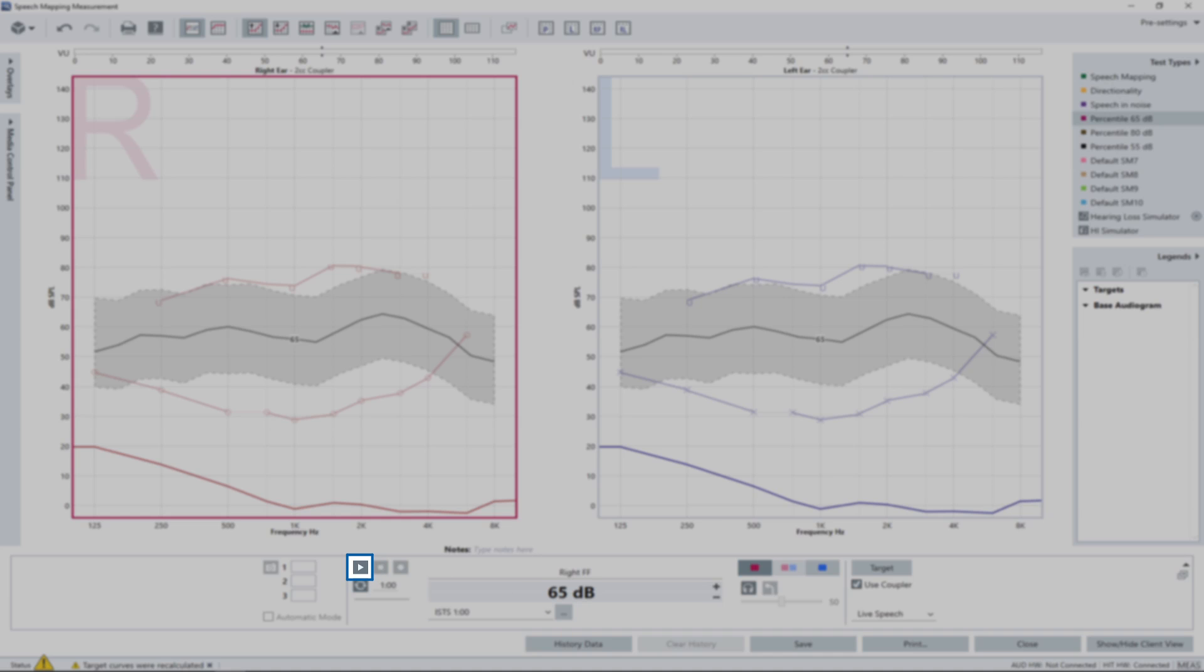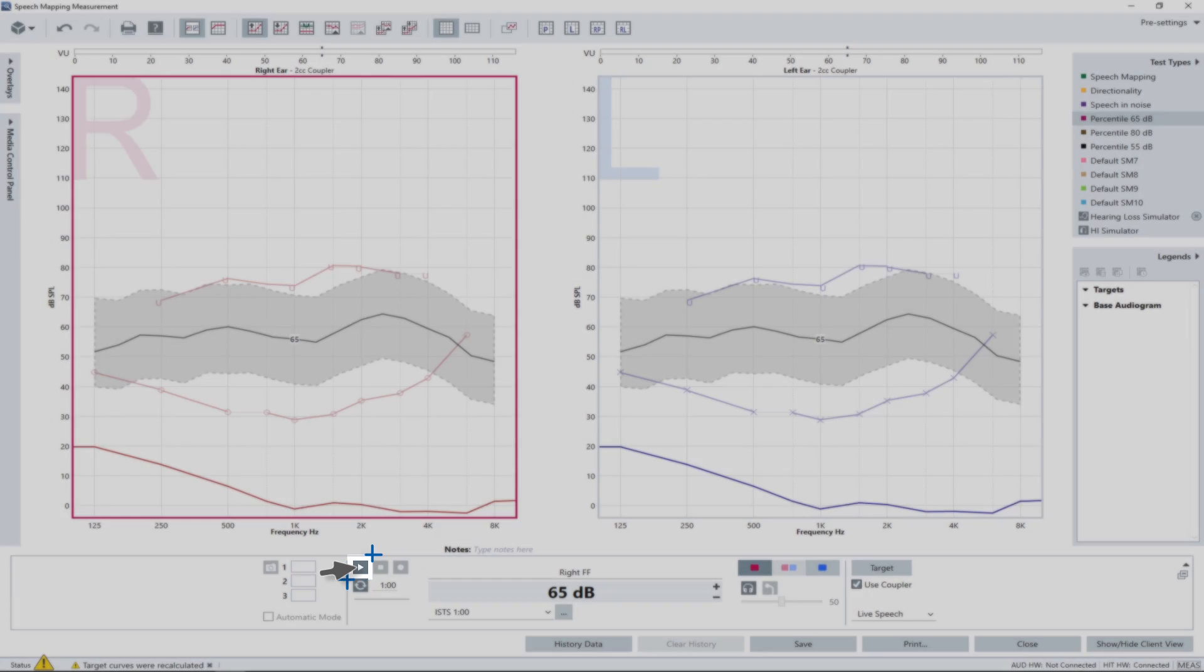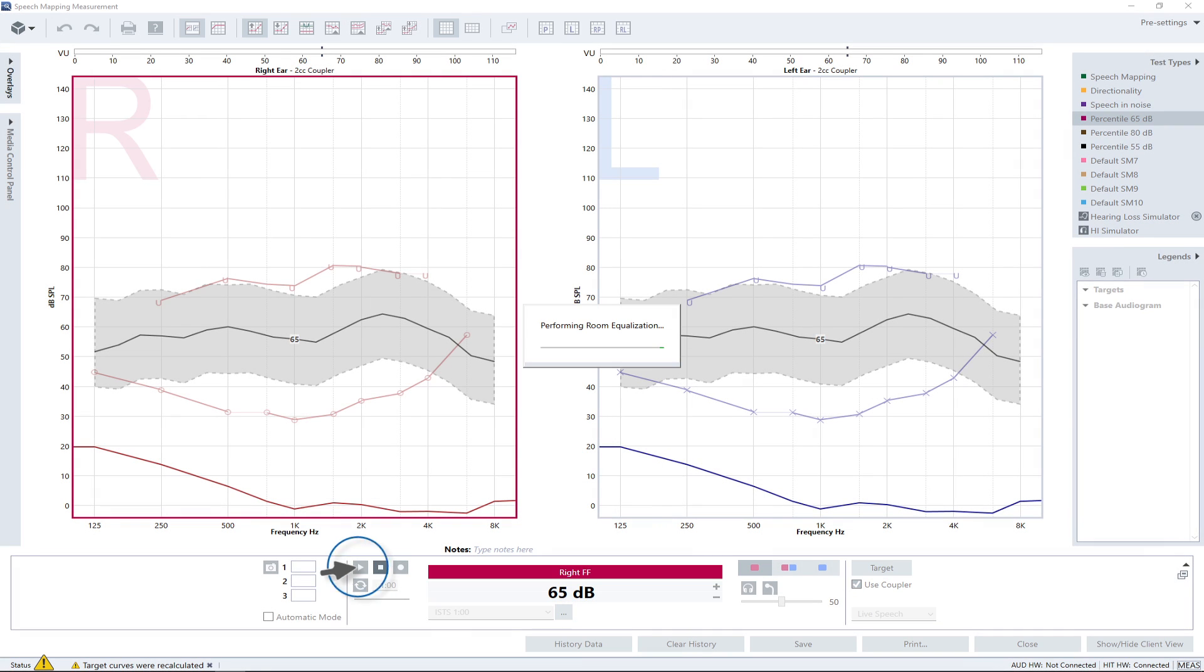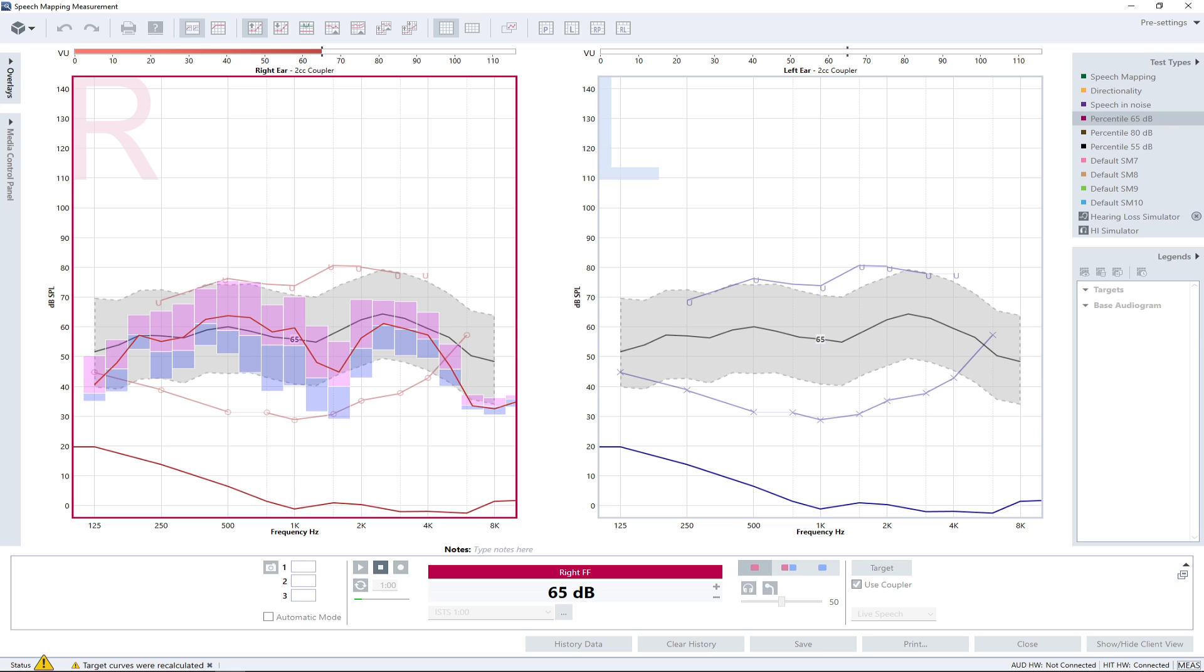To start the measurement, simply click on the play button. Initially a room equalization sound is played. After the equalization has been completed, the measurement will start automatically.